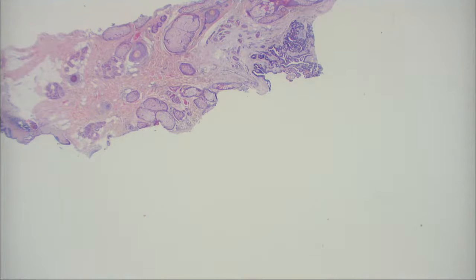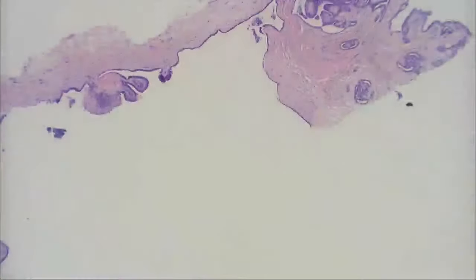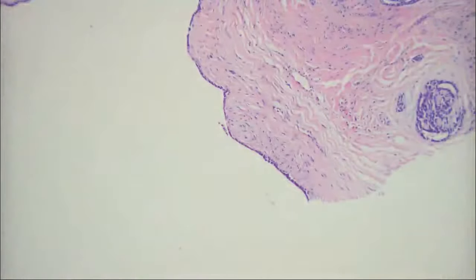No. It's hard to tell what part of the body you're on, but it's certainly hair-bearing skin because you've got these large sebaceous lobules. So it might be the face. It might actually have been the scalp. So how do we approach cysts? We look at whether it's a true cyst based on the lining. Yeah, good, on the lining. So what kind of lining did you see here?